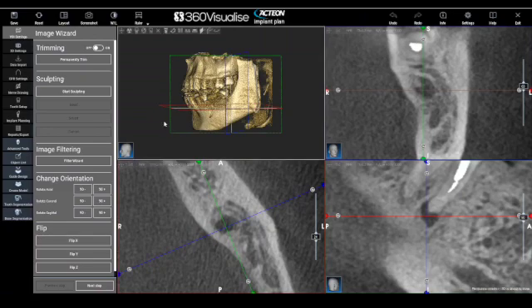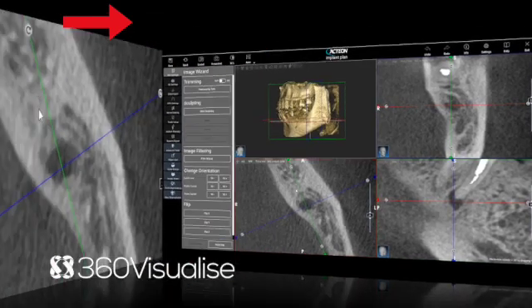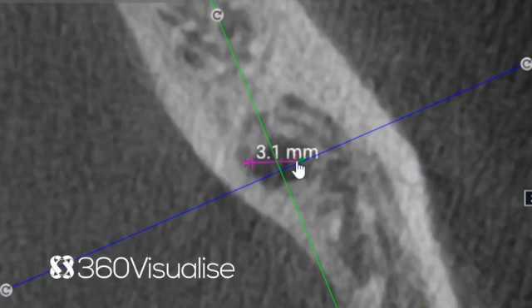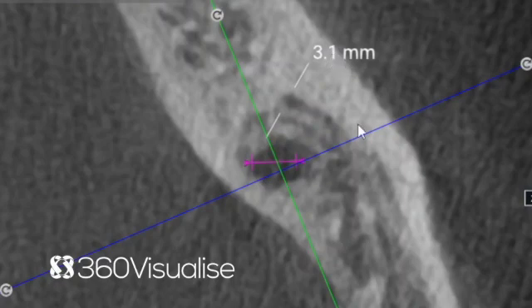We can also measure by clicking on the ruler icon and selecting distance. Click once to start and once to finish the line measurement. You can drag the numbers to move the measurements away from the scan, then drag each end of the line to change the distance.